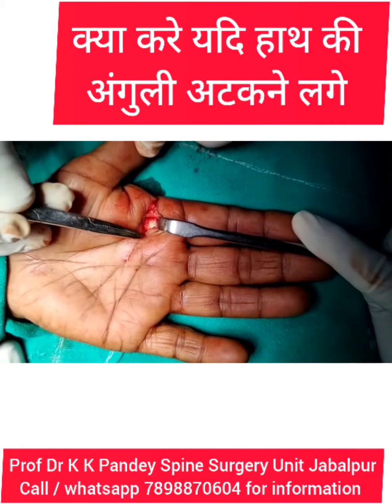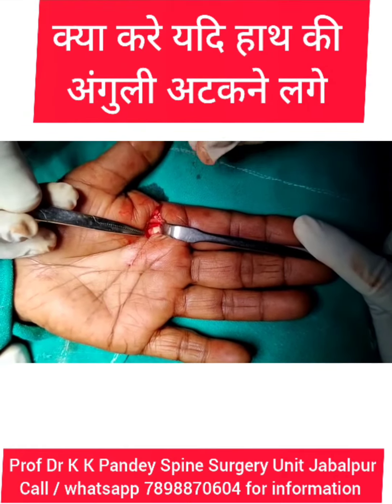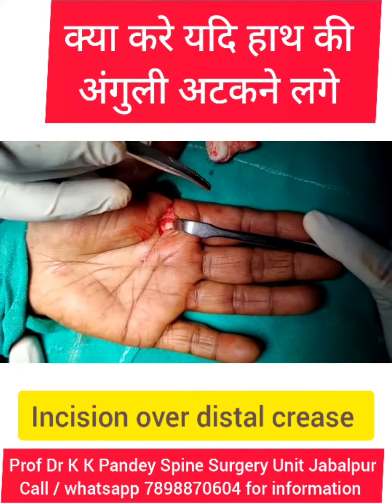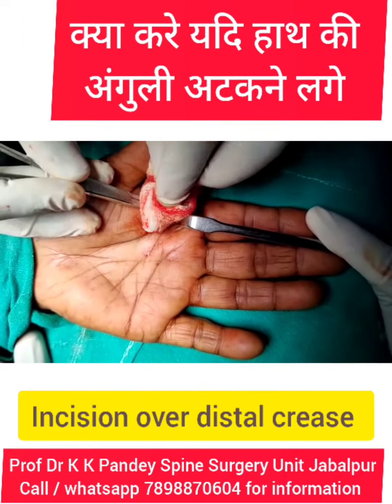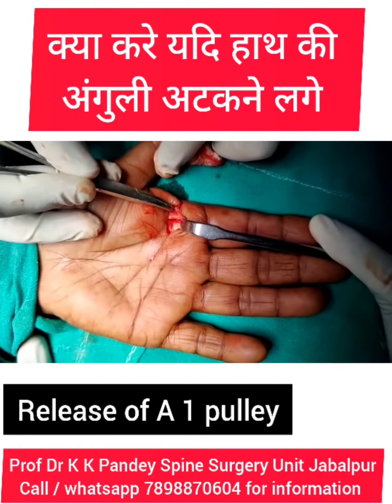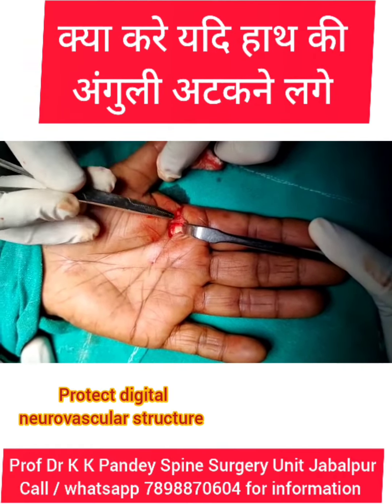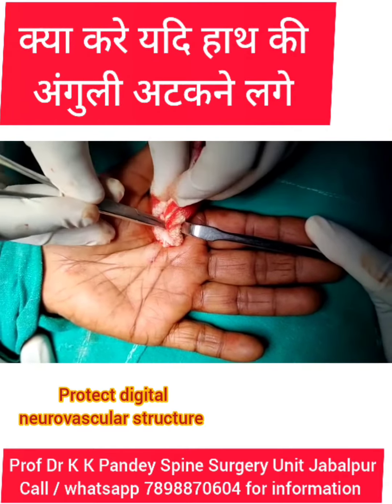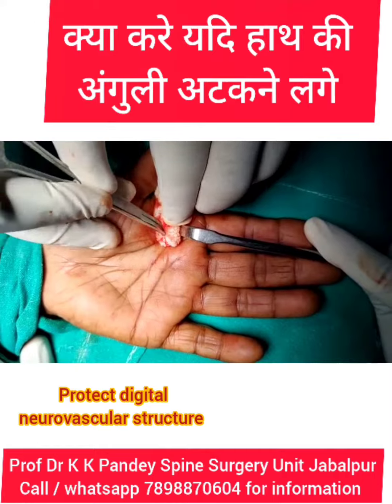This is the incision over the distal palmar crease and there is a trigger finger in the index finger. We open the A1 pulley and we are protecting the digital nerve, and now we will incise this A1 pulley and then the finger will be okay.